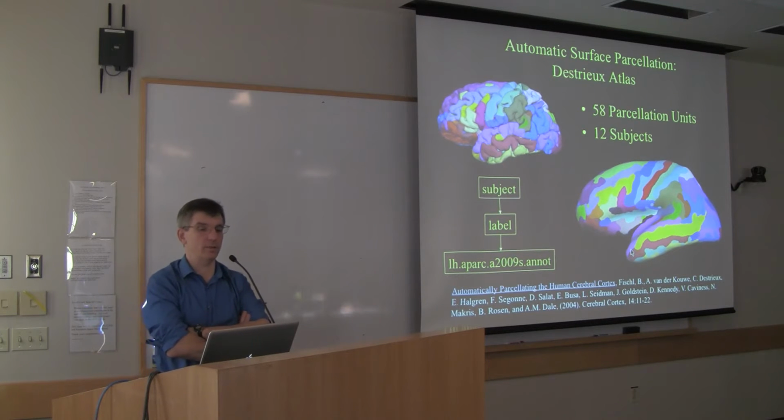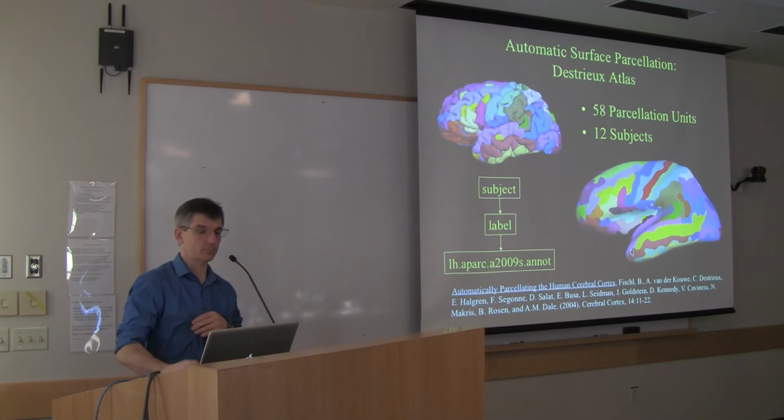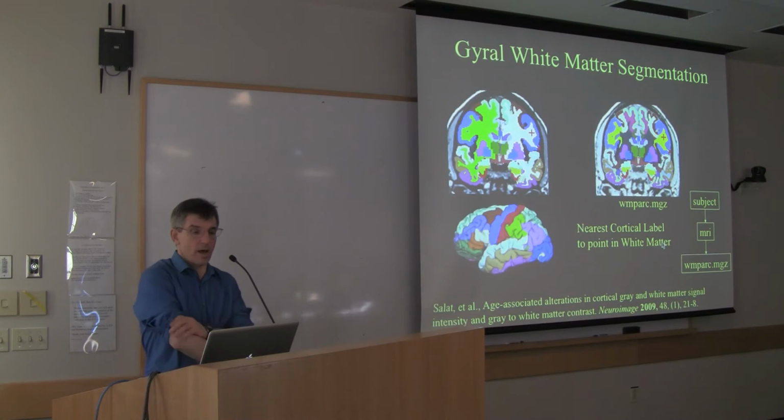So the Desikan and Destrieux atlases are driven by cortical alignment to a probabilistic atlas. So it's trying as best as it can to get the anatomy lined up properly and have these ROIs defined anatomically.